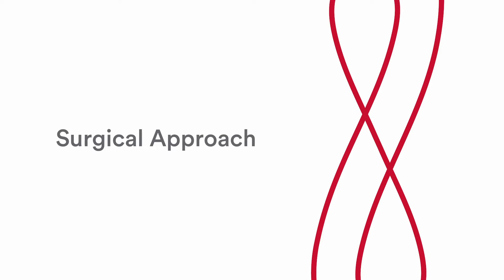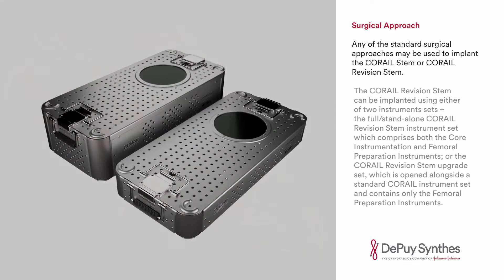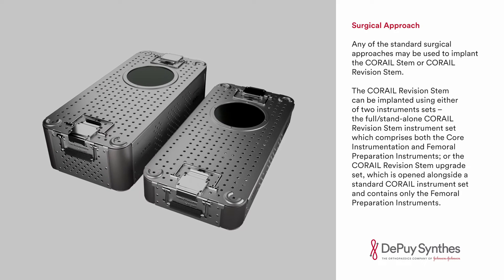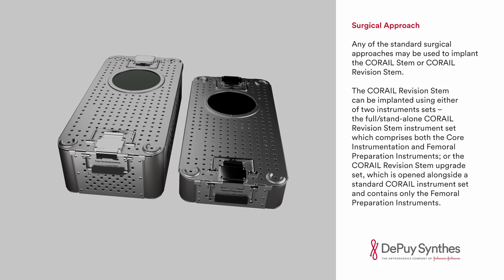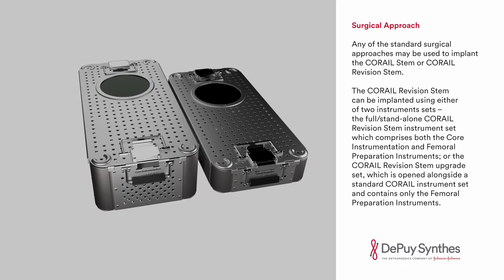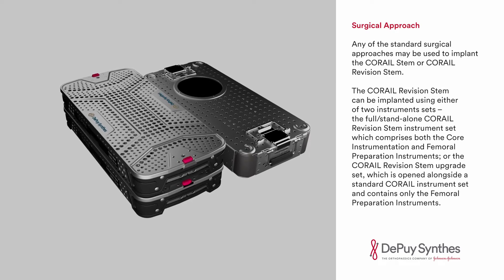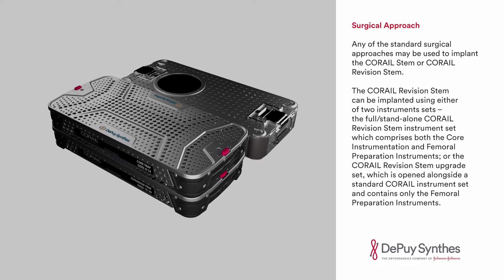Any of the standard surgical approaches may be used to implant the Karai Stem or Karai Revision Stem. The Karai Revision Stem can be implanted using either of the two instrument sets: the full stand-alone Karai Revision Stem instrument set, which comprises both the core instrumentation and femoral preparation instruments, or the Karai Revision Stem upgrade set, which is opened alongside a standard Karai instrument set and contains only the femoral preparation instruments.